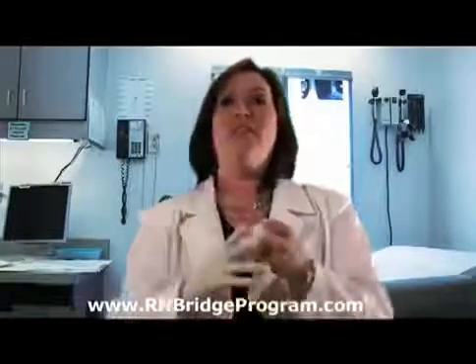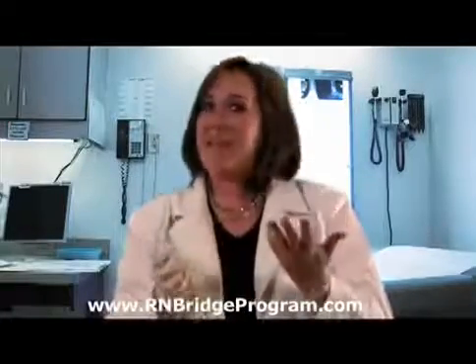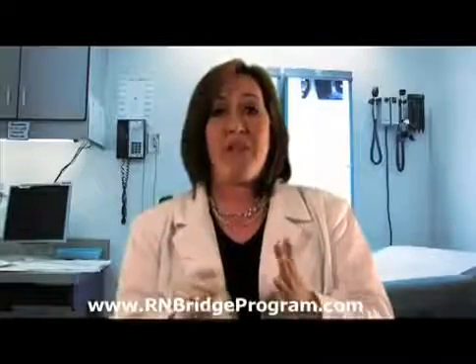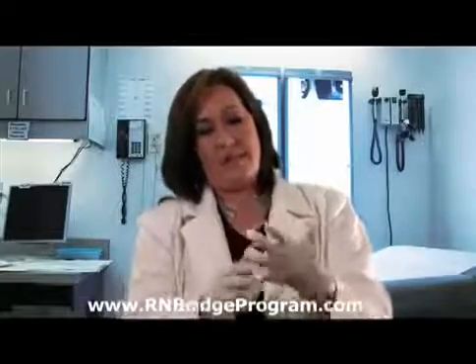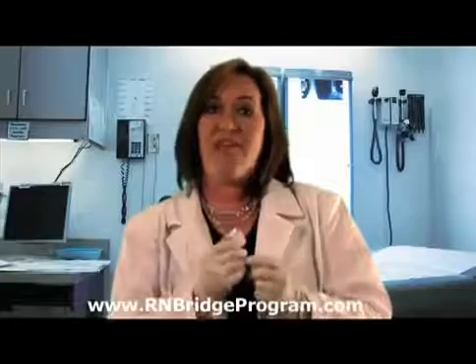So let's go ahead and let's put our gloves on. And again, when we're talking about asepsis, we're talking about covering our hands with gloves. We're talking about not having artificial nails such as what I have on. I'm the instructor today with no real patient. If you had a real patient, nails are a no-no. Even real nails need to be trimmed into your fingertips. Your hands need to be washed prior to your procedure. And then we're going to put these clean gloves on. And then once we get the gloves on, we're going to take the alcohol, because another part of asepsis is actually cleaning the site with alcohol. So now let's go down to our patient.